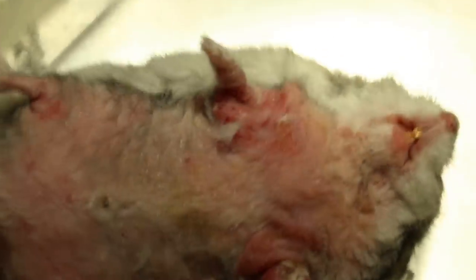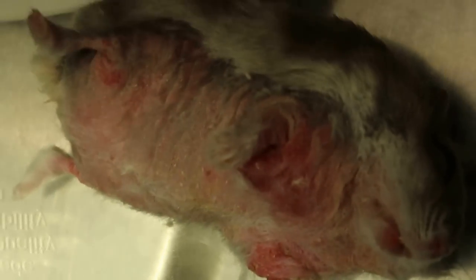Now you can see how useful the gas is. It's easy to do and the hamster is not so stressed out. I mean, if you just grab the hamster and start doing it, of course he will be very stressed out. And luckily this one doesn't bite — this is a very friendly one.